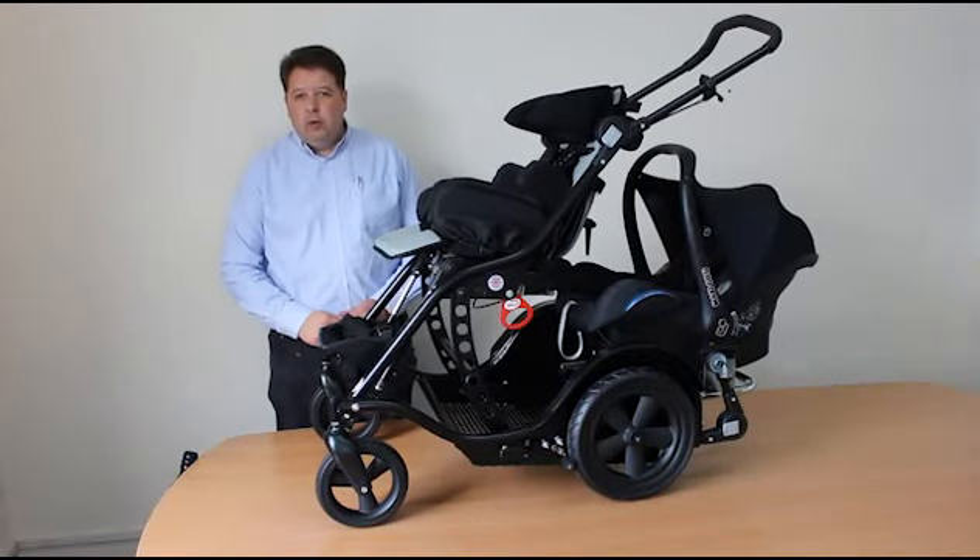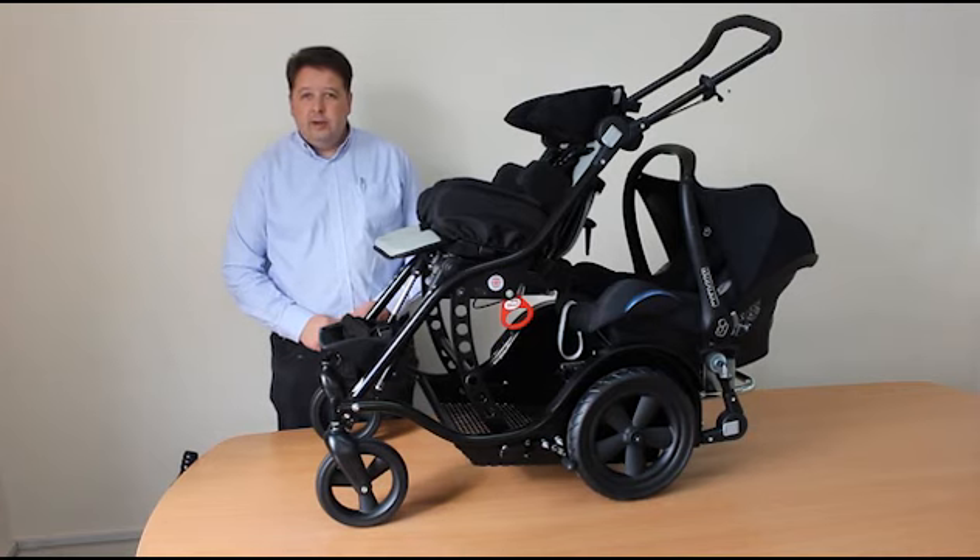So that's a quick walk-through on what the tandem buggy can do. If you're a family that has a disabled child or maybe a younger sibling, this is the sort of solution that can get you out and about and doing things again. It's going to be a little bit bigger than a single buggy on its own, but it really will get you out of the house.